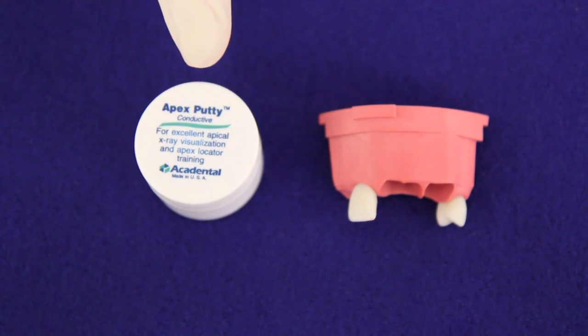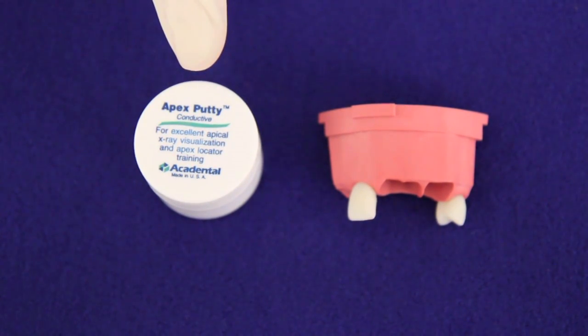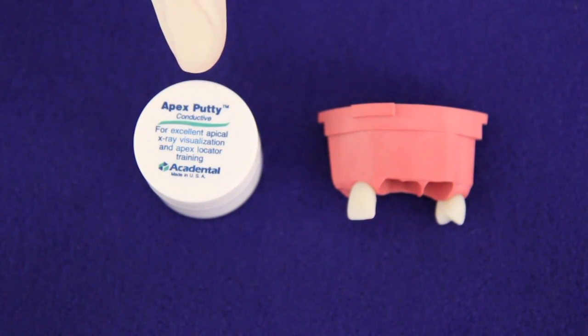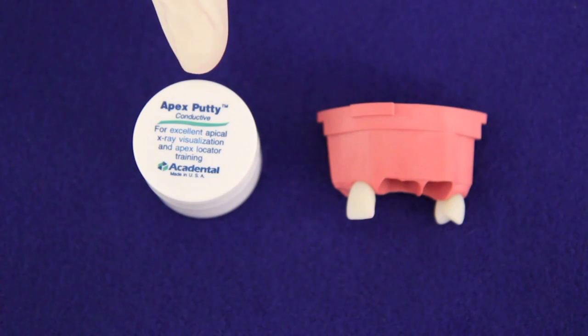Next, we use the apex putty to simulate periapical radiolucency. It's also used for another reason. It's very soft, so its placement around the apex demands that we demonstrate appropriate length control during instrumentation and obturation.